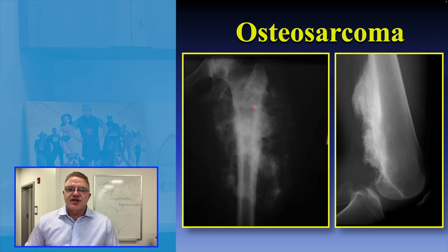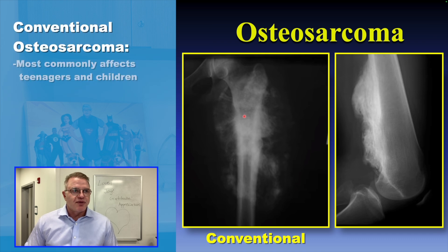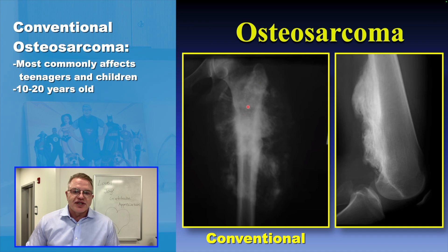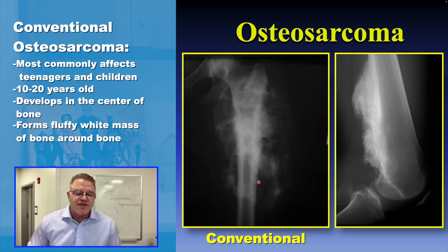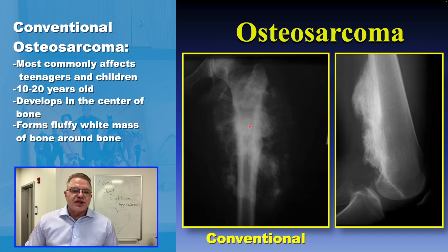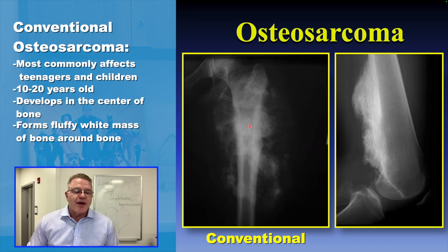These are two examples of an osteosarcoma. The image on the left is a conventional osteosarcoma, which is the most common type of osteosarcoma, affecting teenagers and children primarily between the ages of 10 to 20. We can see that the tumor developed from the center of the bone and formed a very large mass around the bone, producing a white, fluffy, cloud-like substance within it, which is bone. An osteosarcoma is called an osteosarcoma because it is a sarcoma that produces bone — not because it arises from bone, but because it produces bone.